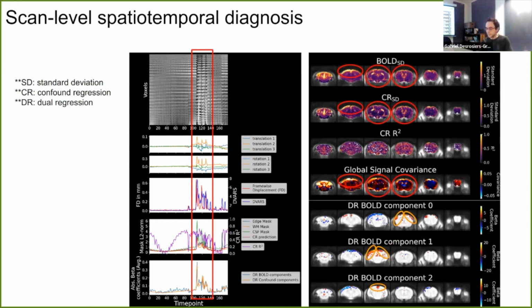So then what I didn't mention is that this particular scan, in this report, was not corrected for anything. And you can see that none of the motion was really corrected for. And I want to ask you, actually, does anyone have an idea of what would be a good correction strategy to do in this case if we want to get rid of those confounds?